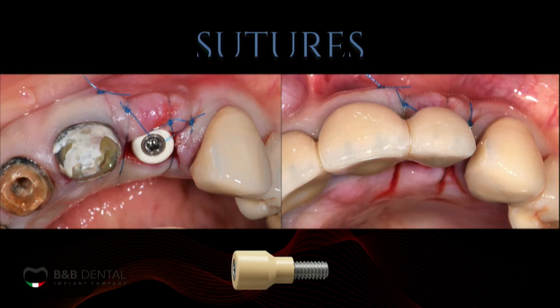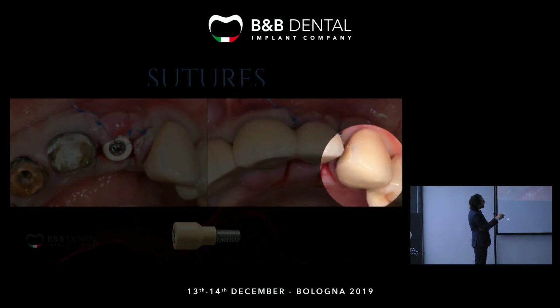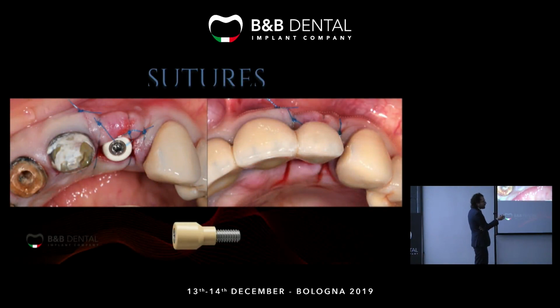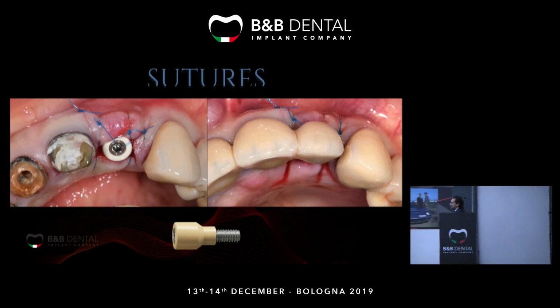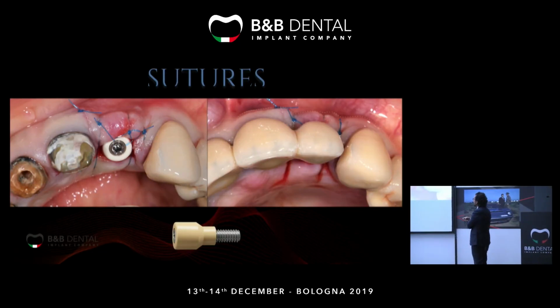And at the same time, we can insert the healing abutment and the roll flap just in the first appointment to do all these changes to the architecture of the soft tissues.